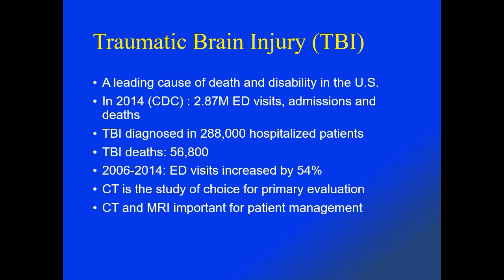And in that year, traumatic brain injury was diagnosed in close to 300,000 hospitalized patients, leading to death in over 56,000 patients. Between 2006 and 2014, ED visits due to potential traumatic brain injury increased by 54%. CT is a study of choice for primary evaluation, with additional CT and MRI, which can be used for further patient management.